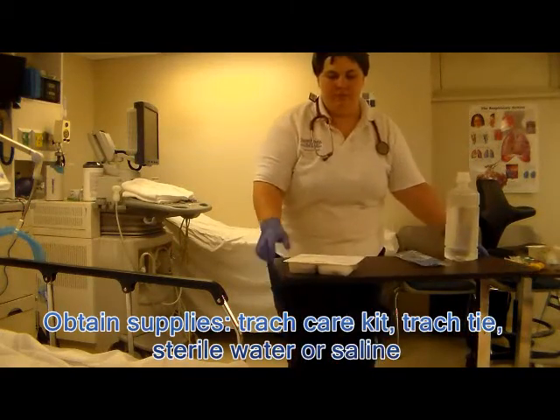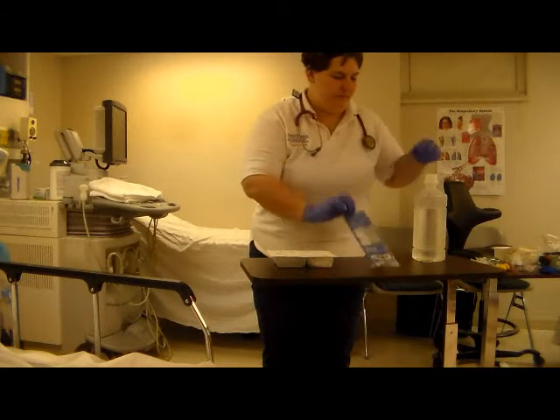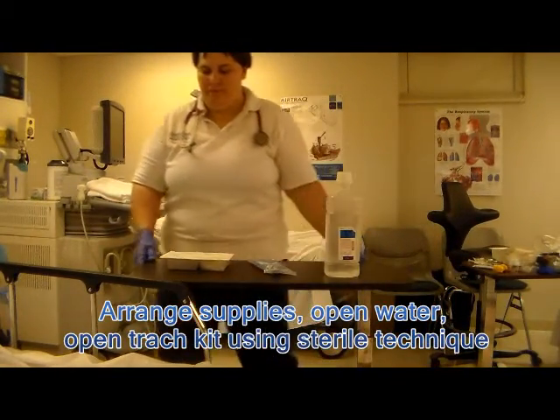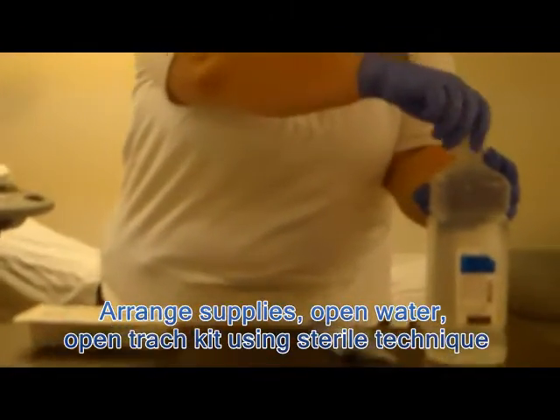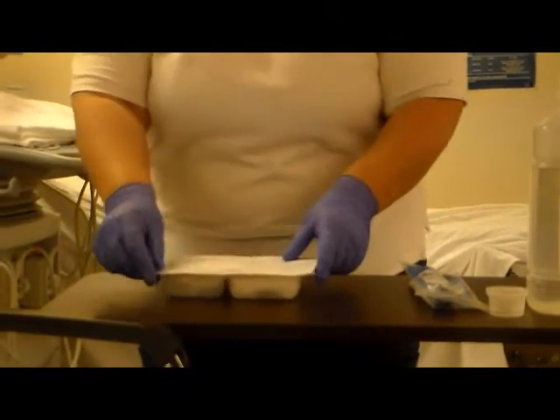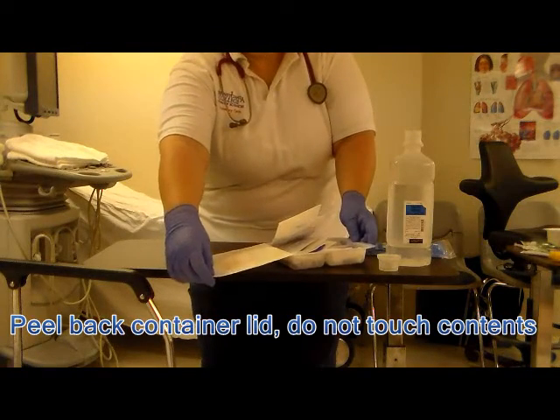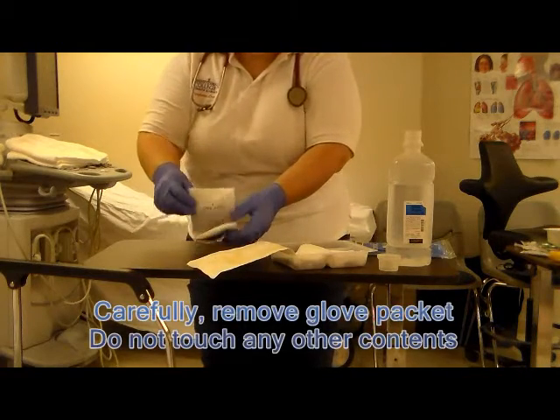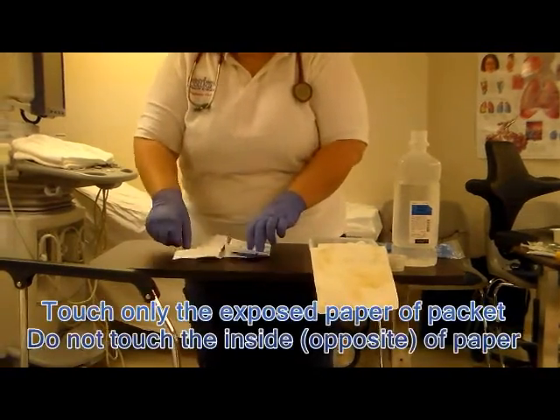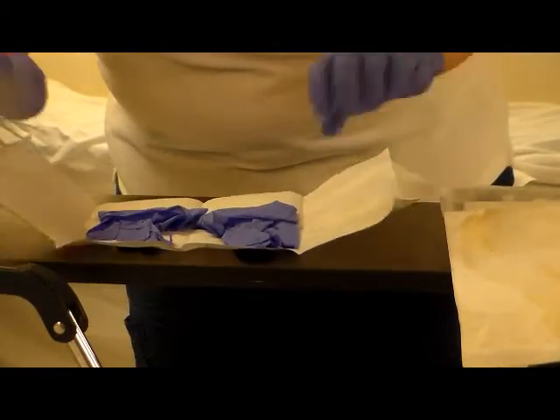Obtain your trach care kit, your trach ties, and sterile water. Take your kit and open it up using sterile technique, first loosening up the cap on your sterile water. Taking the sterile glove packet out of the tray — do not contaminate anything from the inside. Using your sterile technique, which we've talked about before, open up the package.